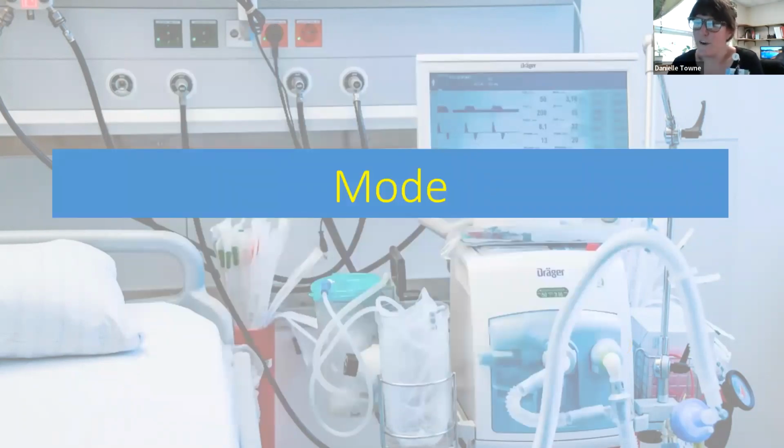So then we need to figure out what mode we want to be in. There are three conventional modes: assist control, SIMV, and pressure support. And while there are other ventilator modes, we're going to focus on assist control and SIMV for this lecture to understand the difference between those. We're not going to talk about pressure support, so it's typically used during more of your weaning phase when you're getting ready to try to move towards extubation. We're just not going to talk about it here in this lecture.